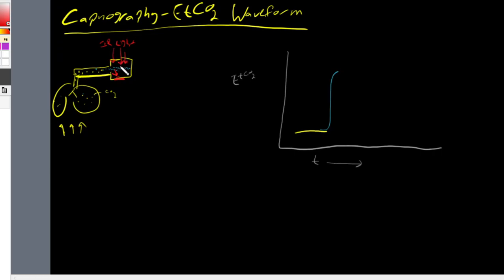So if we shoot 3 photons of light at this point where our carbon dioxide is starting to fill the chamber, then we're likely getting, let's say, again, arbitrarily, 1 out of it. This chamber is going to start to have more carbon dioxide, which is going to absorb more infrared light, which is going to reflect in less being sensed at the other end of our sensor.